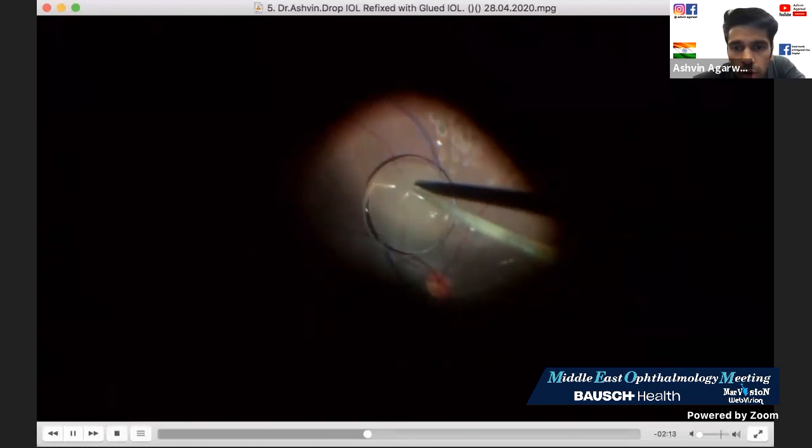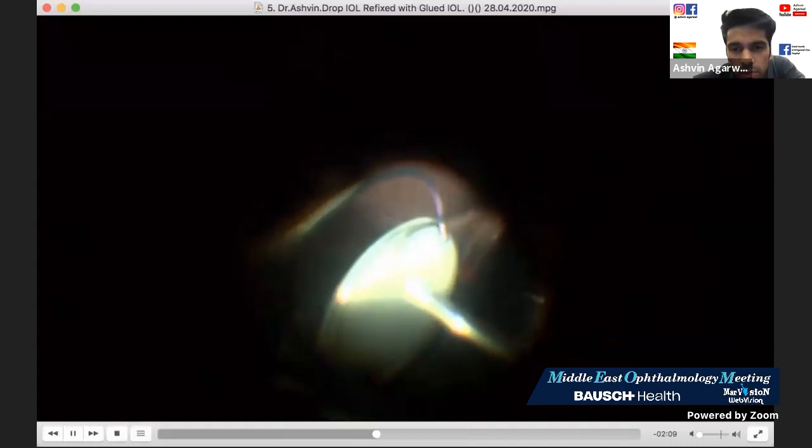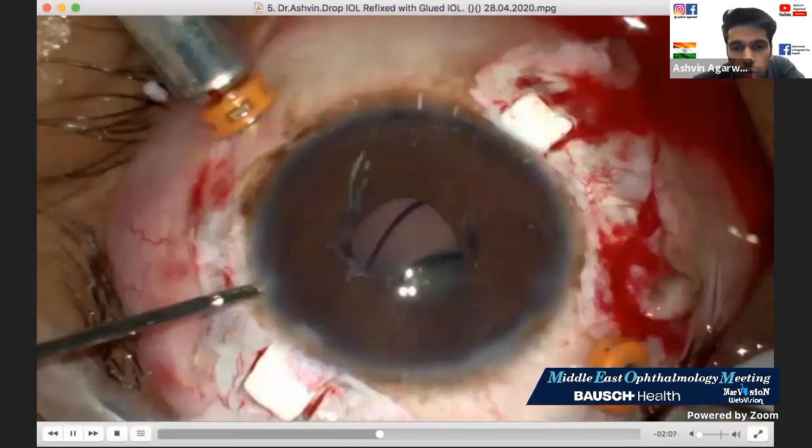Once I'm done with my vitrectomy, so here we have, this is the extrusion cannula. I just go adhere on top of the optic, and that's it. And that's pretty much what I'm doing. I'm not even going close to the retina or anything.